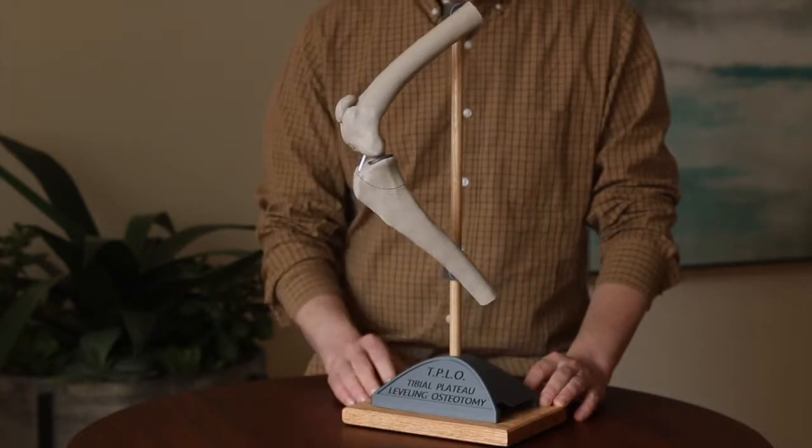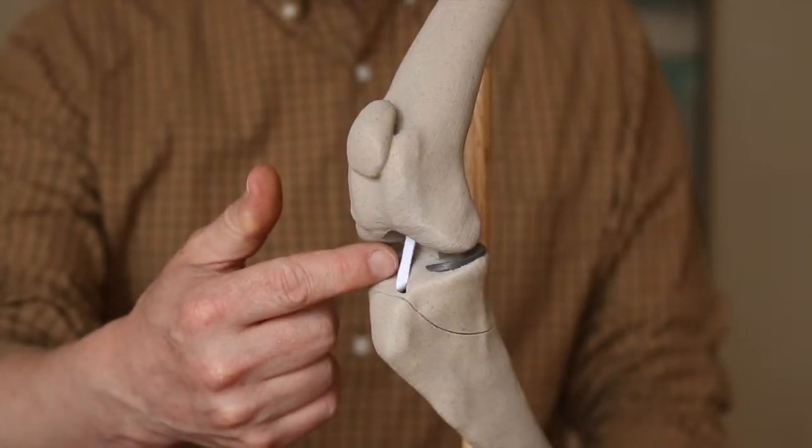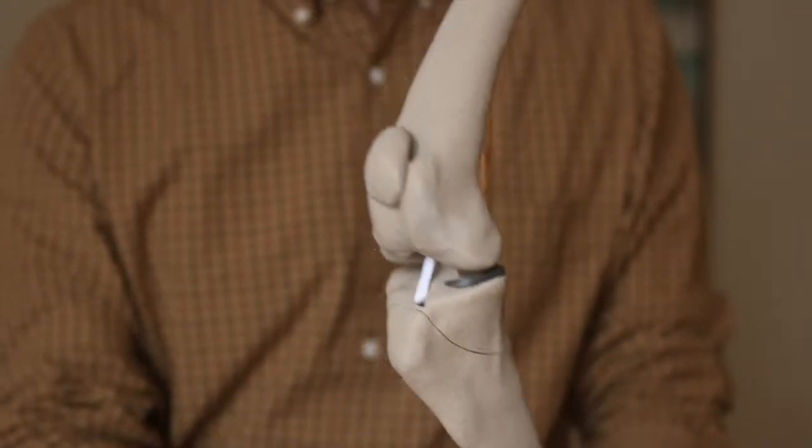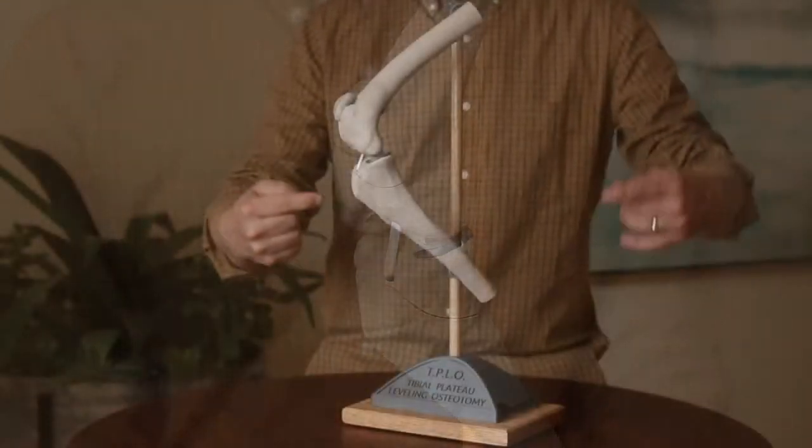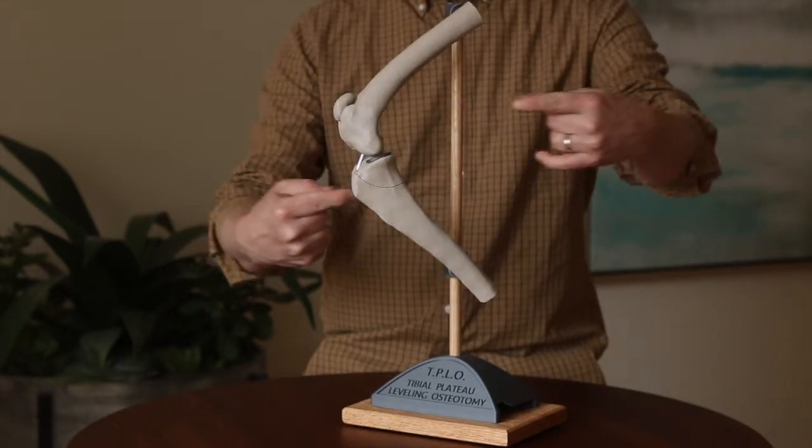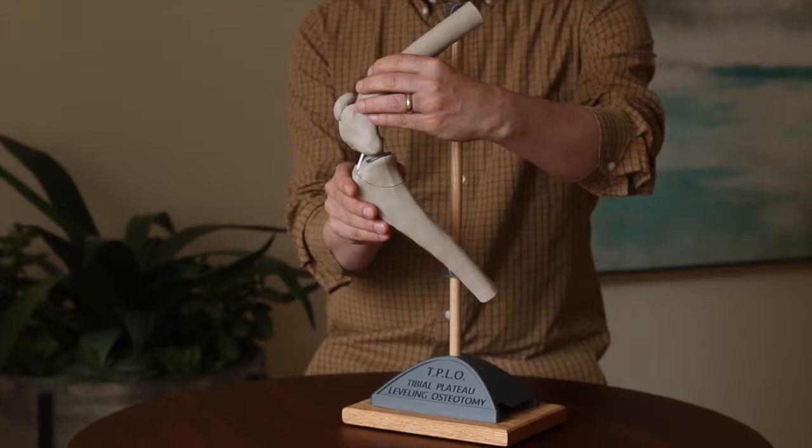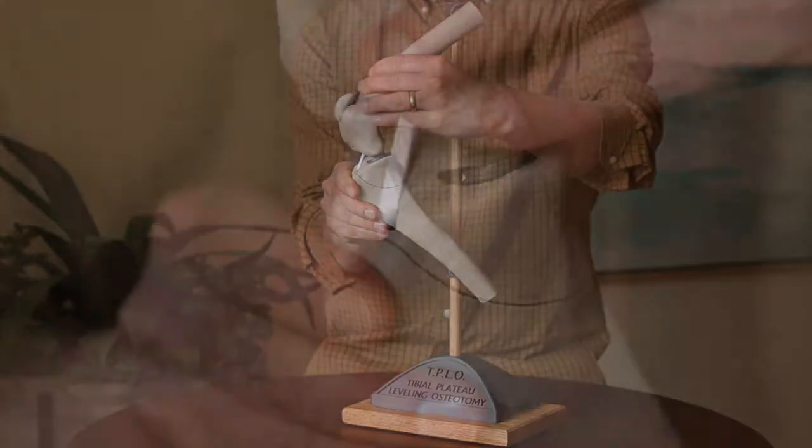This white band here represents the cranial cruciate ligament that we've been talking about. You can see it allows the knee to do its normal flexing and extending, but its main job is to prevent front-to-back shifting of the femur and tibia. So I can use my hands to try to cause this type of shifting, and you can see when I do that the ligament tenses to take the load.